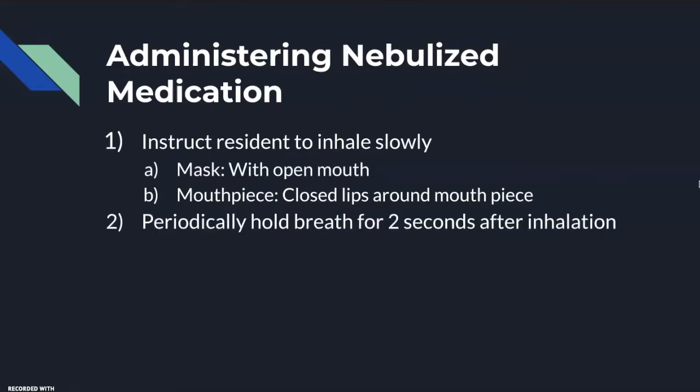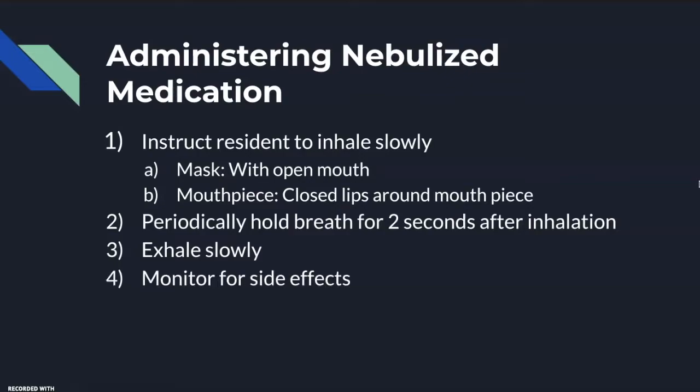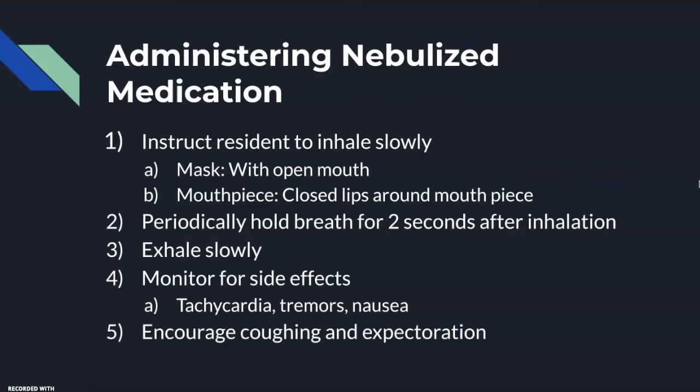You want to instruct the resident to periodically hold their breath for 2 to 3 seconds and then exhale slowly. You should be monitoring the resident for presence of any side effects such as tachycardia, tremor, and nausea, and when the treatment is finished, encourage coughing and expectoration.